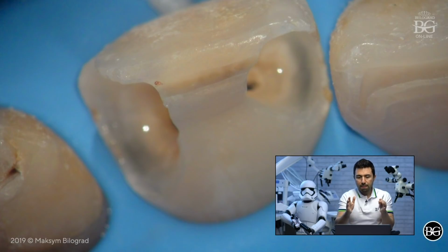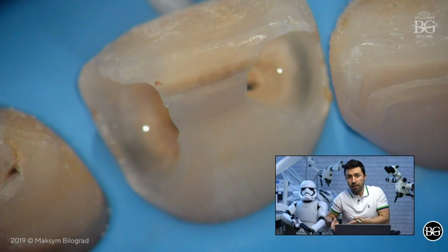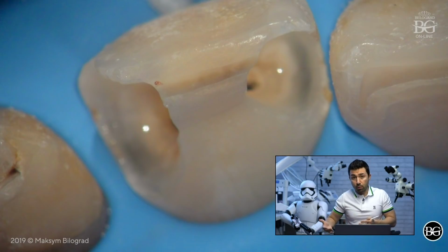In this case, the root canal was straight, the root canal was wide, and I was able to negotiate the root canal even from that access. So at the very beginning, I kept my access as small as I could, and then I started to negotiate the root canal, and then I found out that this access was not in my way to perform endodontic treatment properly. So basically, we decided in this case to keep this access minimal. We have tons of benefits from keeping this access minimal.